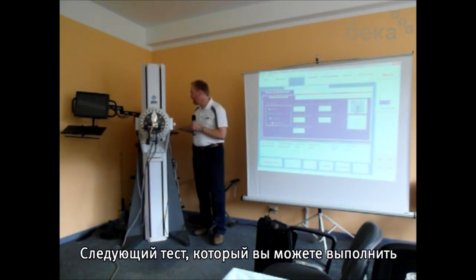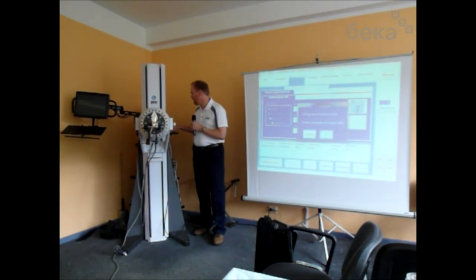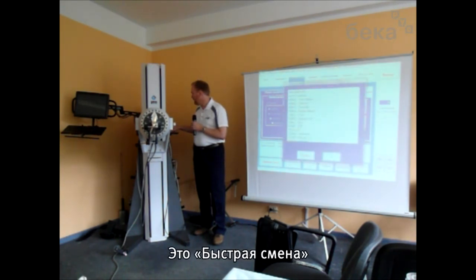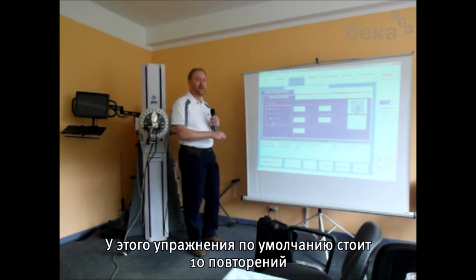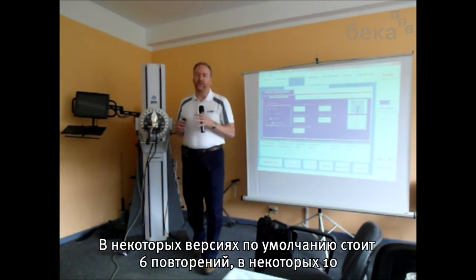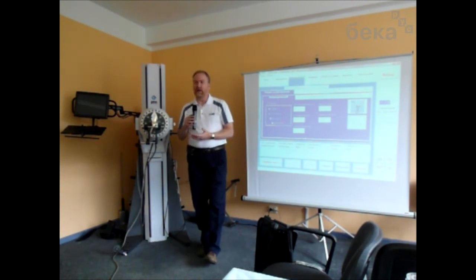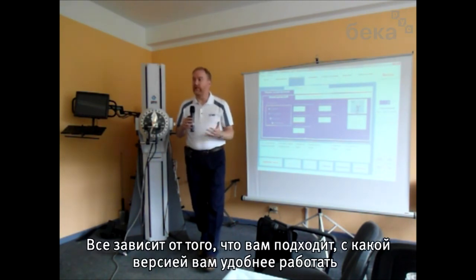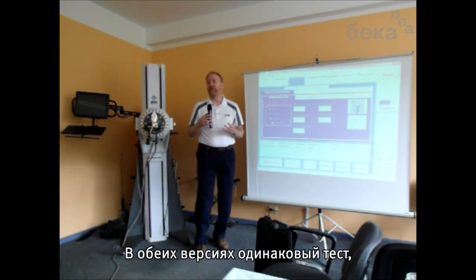Now the other test you can do, if we go back to our templates, is the rapid exchange. This one defaults to 10 repetitions. There are different versions of this particular protocol. Some versions say that you should do 6 trials, some say that you should do 10. It just depends on which one you're following, which ones you're more comfortable with. Both of them follow the basic same process though.